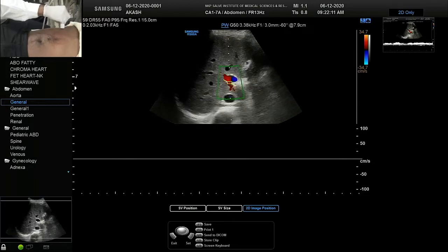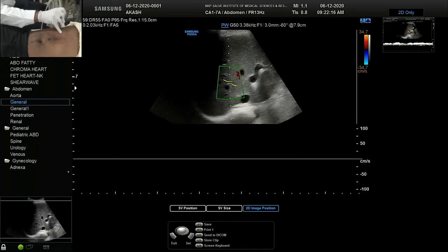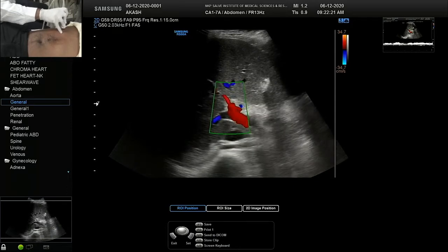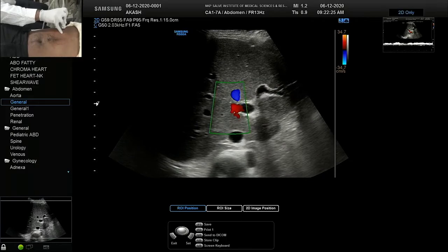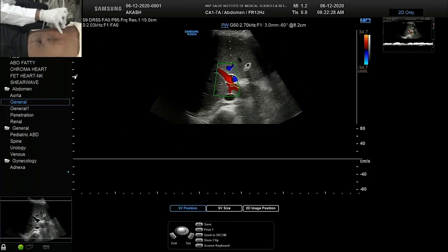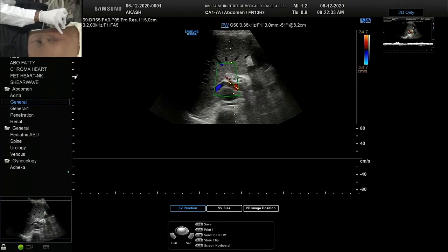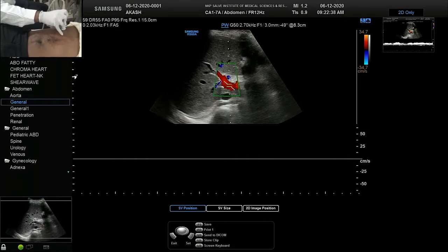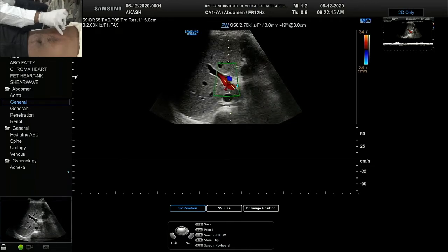It is not required for us to demonstrate the increase in the portal vein size in deep inspiration or expiration. So the physiological flow itself should be seen. Do it again, spectral Doppler, a little bit of angle correction to the direction of the portal vein. The angle correction should always be parallel to the walls of the vessel. That is the rule. Breathe slowly, gently, not too forcefully.